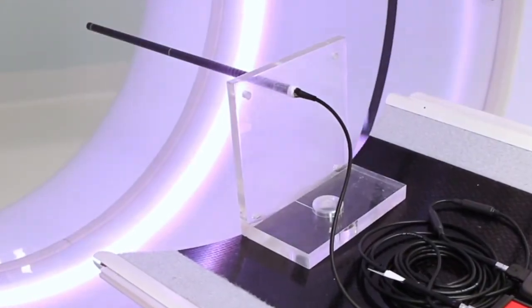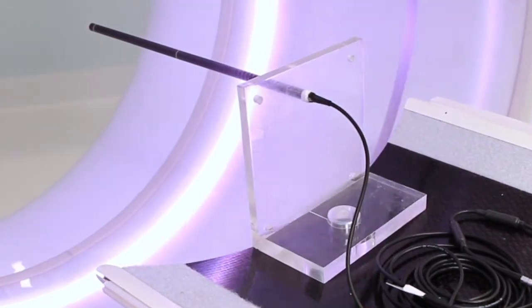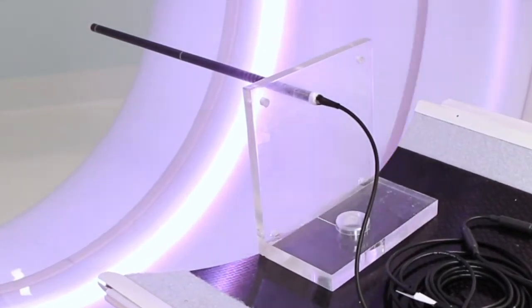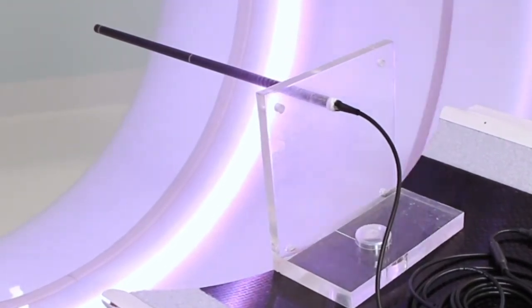Place the ion chamber into its holder and onto the patient table and fixate it properly to prevent it from moving. Since there are various holders on the market, we will not guide you through this step.